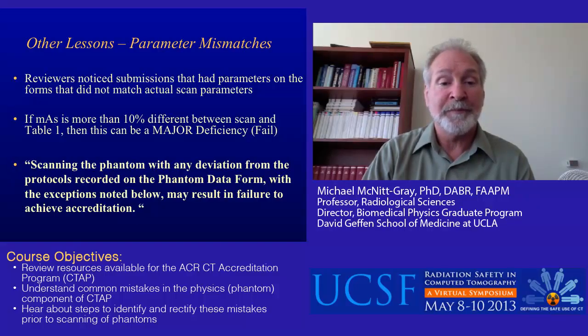And you can see the quote here from the ACR manual. Scanning the phantom with any deviation from the protocols recorded on that phantom data form, with the exceptions noted below, you can see in the instructions, may result in failure to achieve accreditation.